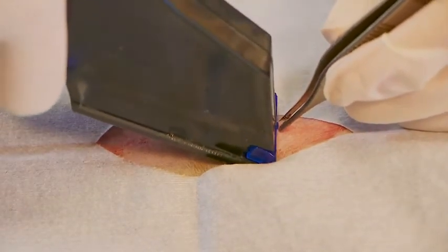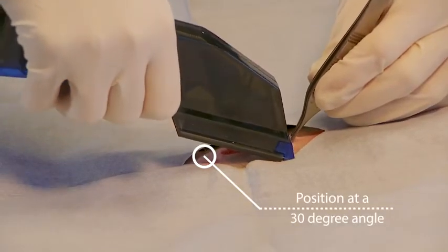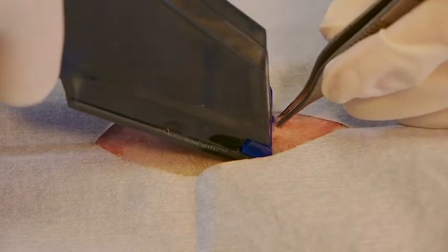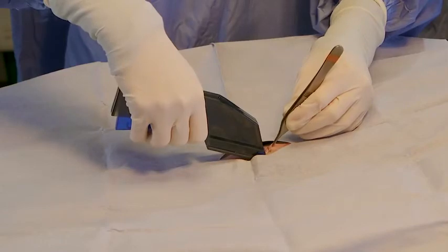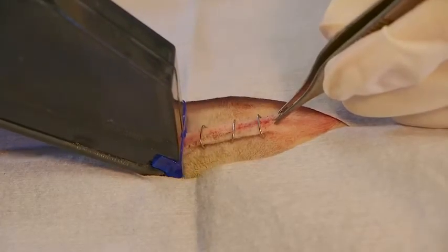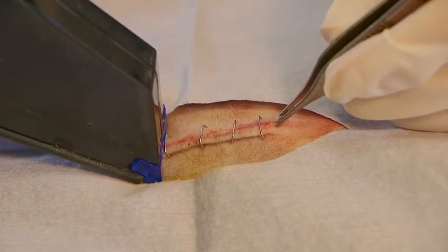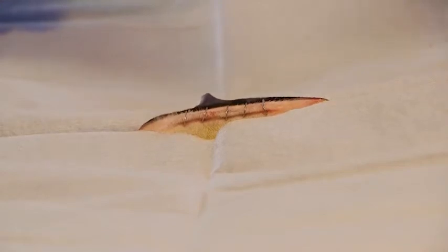To use the stapler, place it over the incision at a 30-degree angle and press the trigger until a small click is felt. After the click, release the trigger and slide the stapler down the incision to fully disengage the staple from the cartridge. To place additional staples, simply slide the stapler along the incision line without lifting it from the patient.